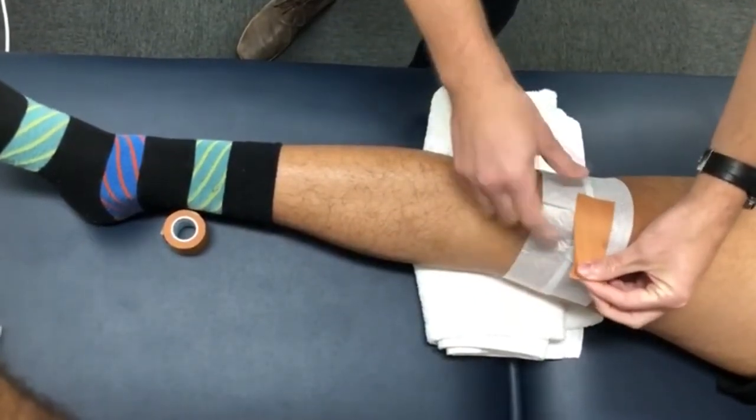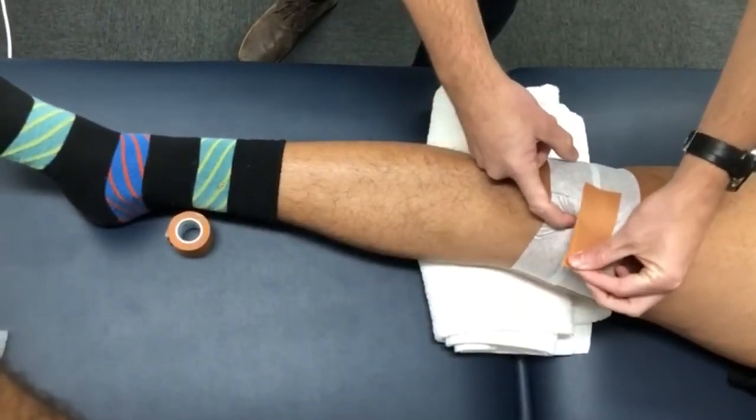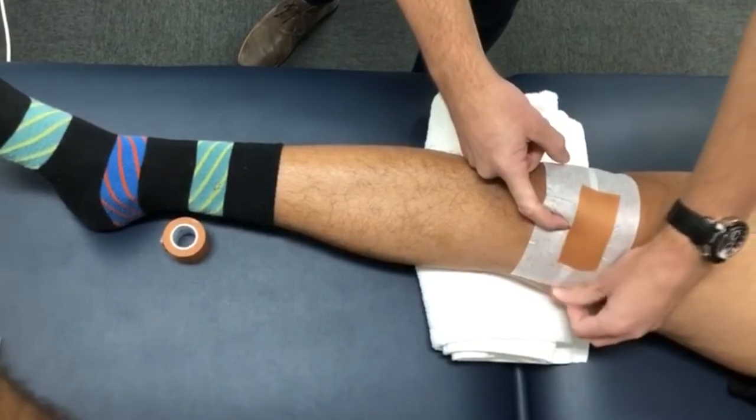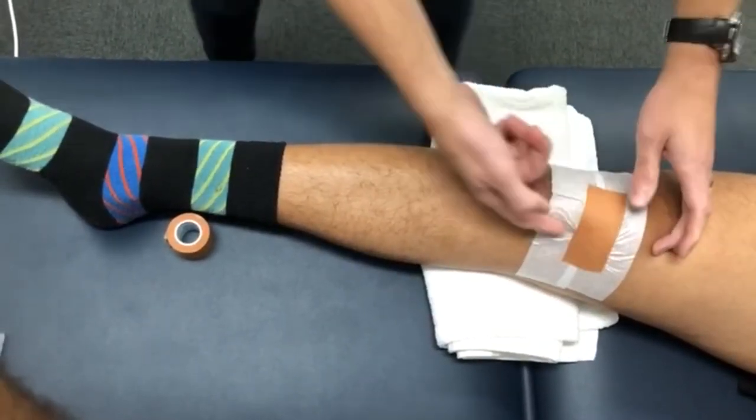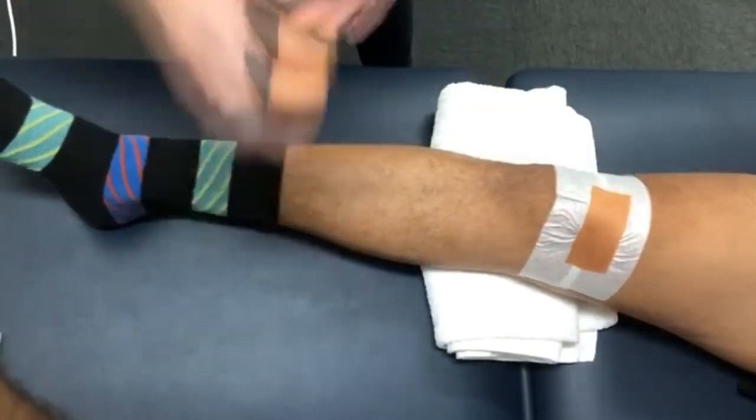Then you're going to use your other hand to feel the inside of the kneecap and hold that down while you paste the other side, rubbing it so the glue is activated and heated and sticks really well, creating this pucker-like effect as you can see with this fold.